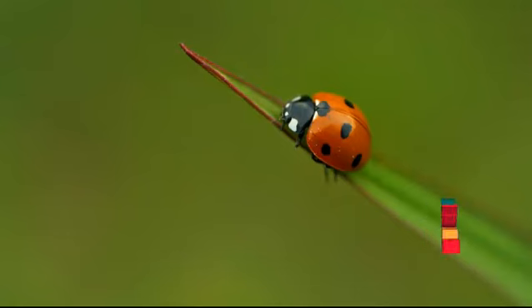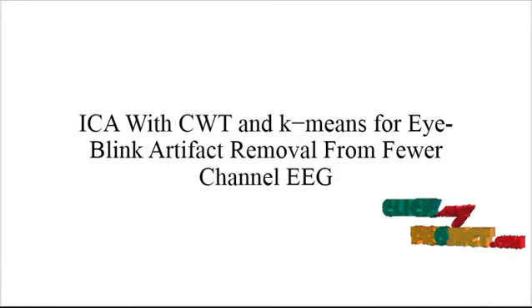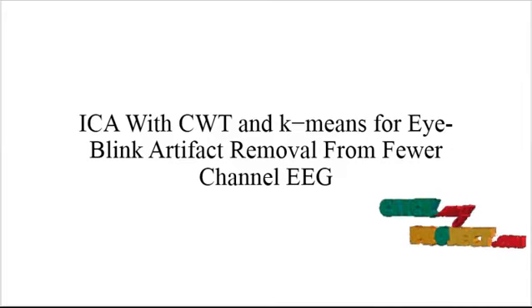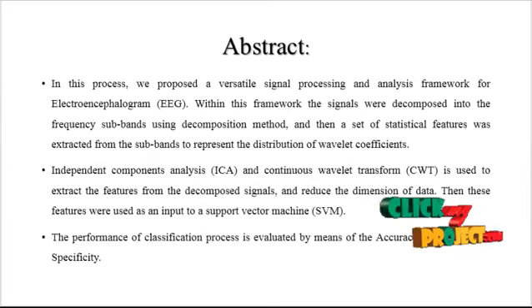Welcome to ClickMyProject.com. Now we are going to discuss the project ICA with CWT and K-means for eye blink artifact removal from few channel EEG. Now we are going to discuss the abstract of the process.